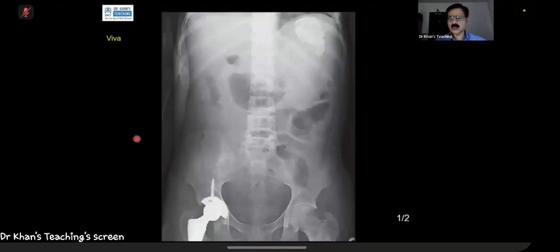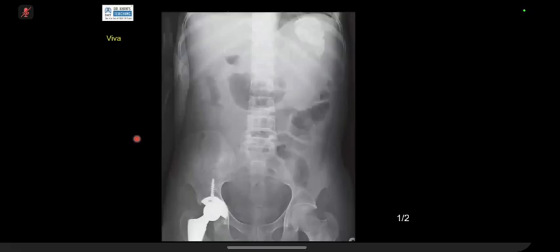Okay, madam. So, what is your conclusion? My conclusion: this is maybe a case of sickle cell anemia. Okay, thank you. Well done.